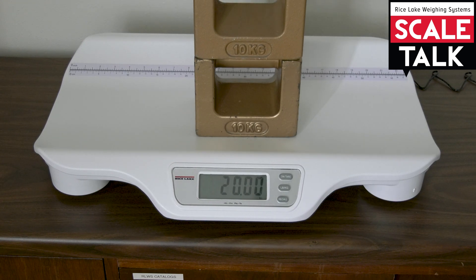Give it a moment — it says 'end' and then comes back out into operating mode and shows us 20 kilograms. Calibration is now complete.